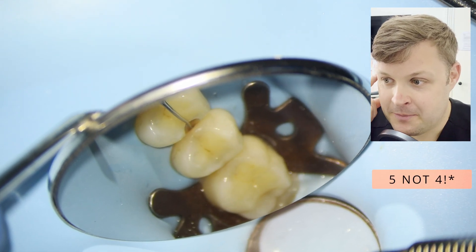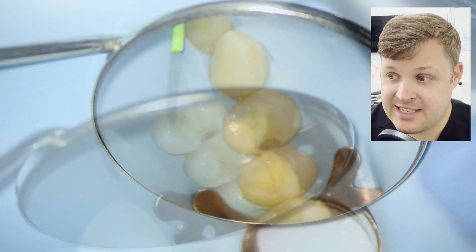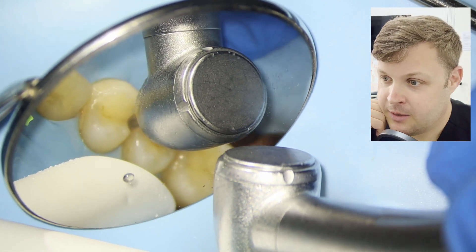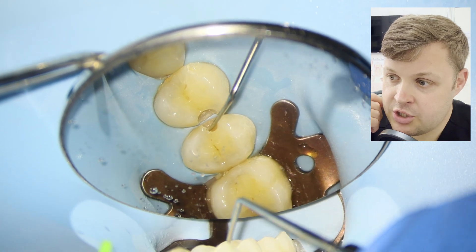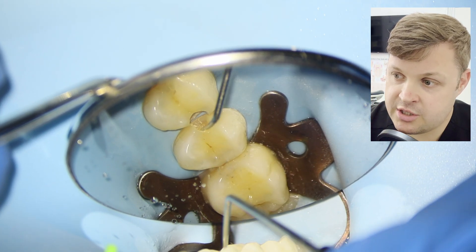We're having a look with a probe here because sometimes that can just be staining, but in this case it was decay and we had to remove it with fast and slow handpieces. I'm just using a probe to feel the base of the cavity to check if there's any decay left.